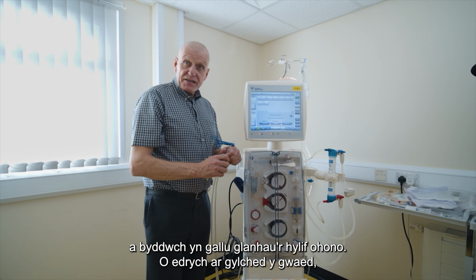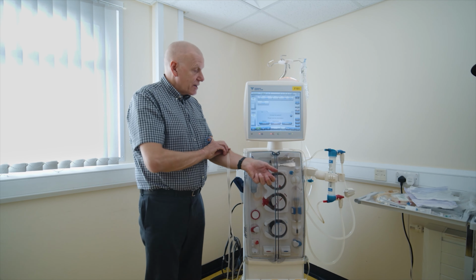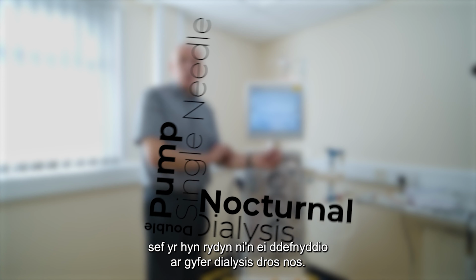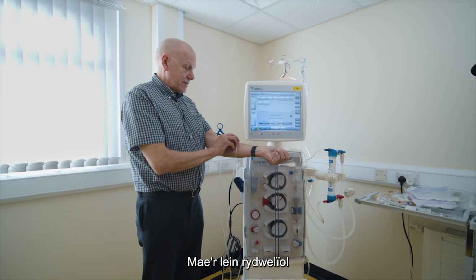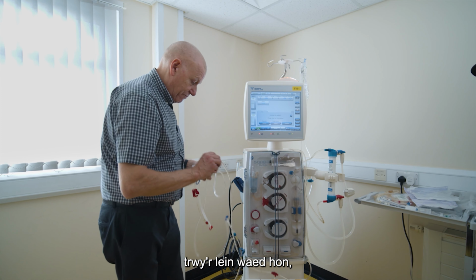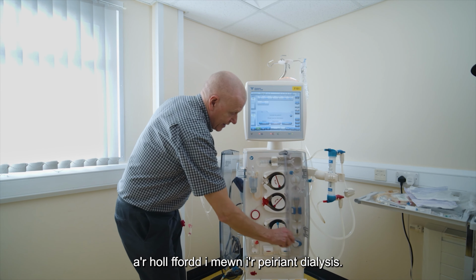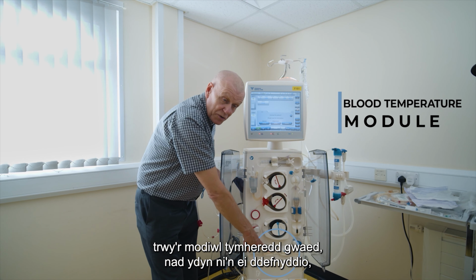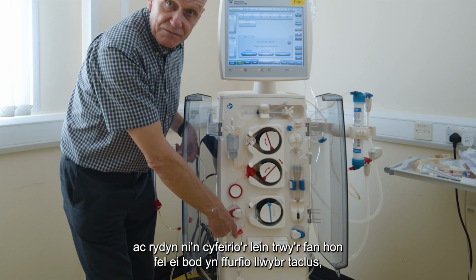Looking at the blood circuit, you have your blood lines, which are connected to your fistula in your arm. This particular setup is for double pump, single needle, which is what we use for nocturnal dialysis. The arterial line takes the blood from your fistula through this blood line all the way into the dialysis machine. It comes in at this side over here through the blood temperature module, which we don't use, but we route the line through there so it's a tidy route.